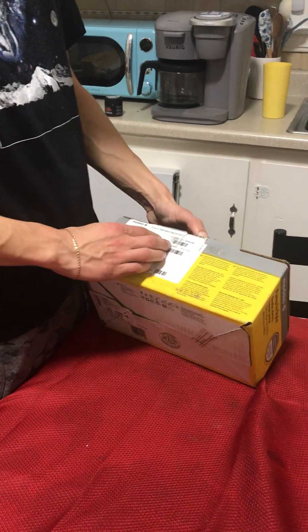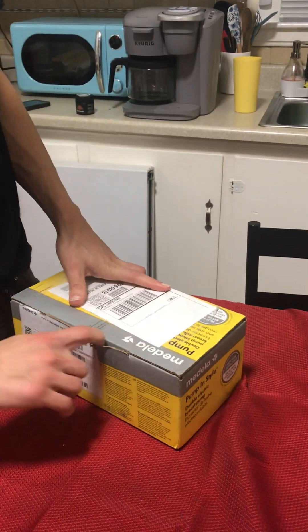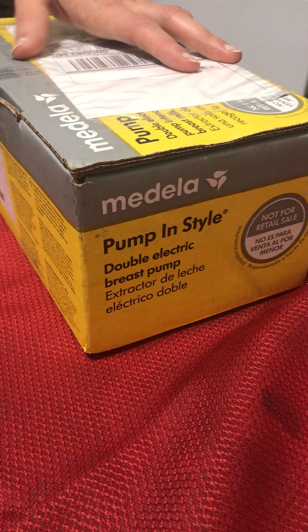We're opening up the free breast pump we got from our insurance. It's called the Medela Pump in Style — a double electric breast pump.